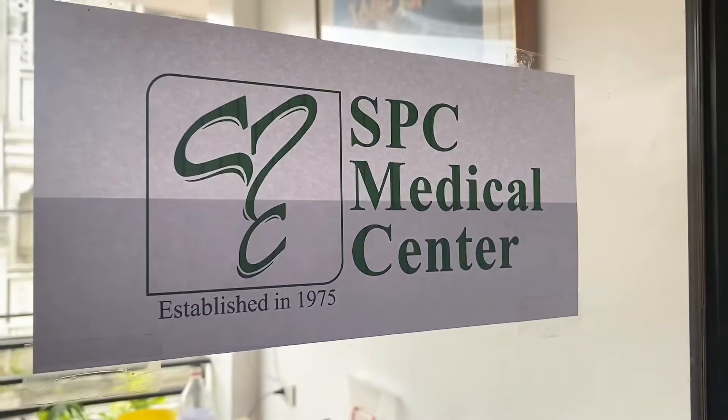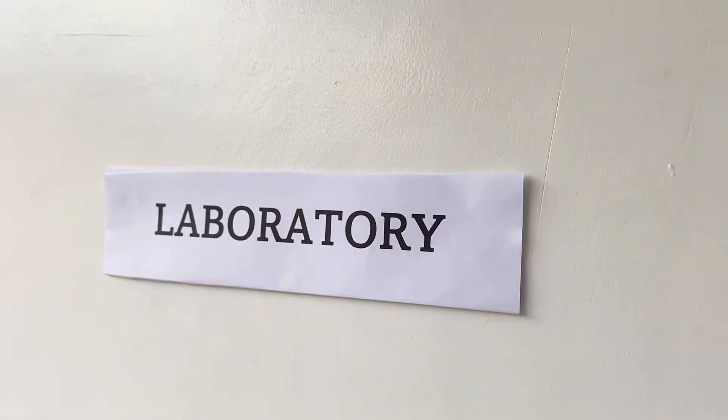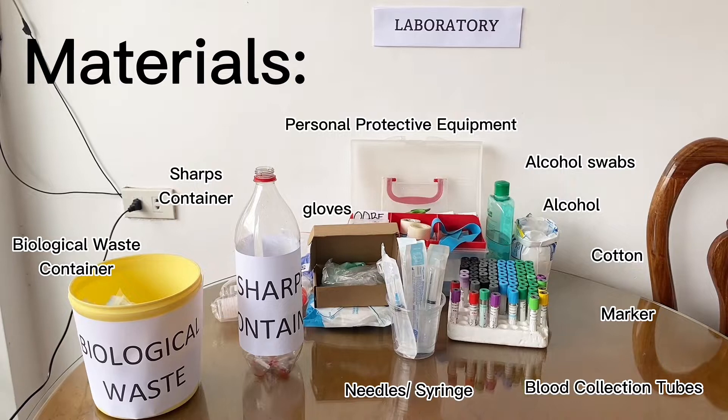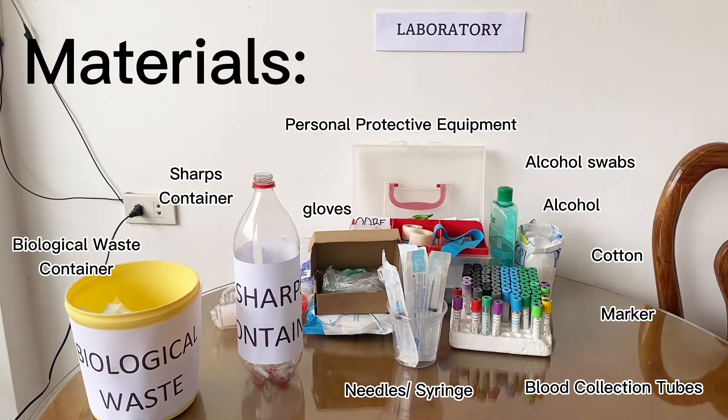Welcome to SPC-MC Medical Center Phlebotomy Section. For the materials needed, we need the personal protective equipment, alcohol, gloves, cotton, marker, blood collection tubes, needles or syringe, sharps, and biological waste container.